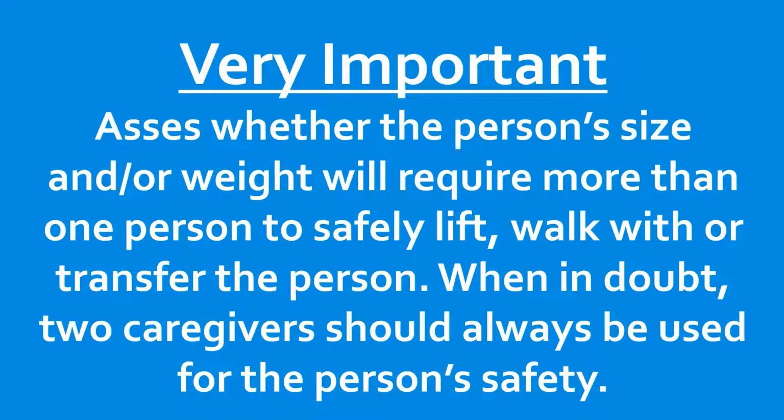Make sure to assess whether the person's size and/or weight will require more than one person to safely lift, walk with, or transfer the person. When in doubt, 2 caregivers should always be used for the person's safety.